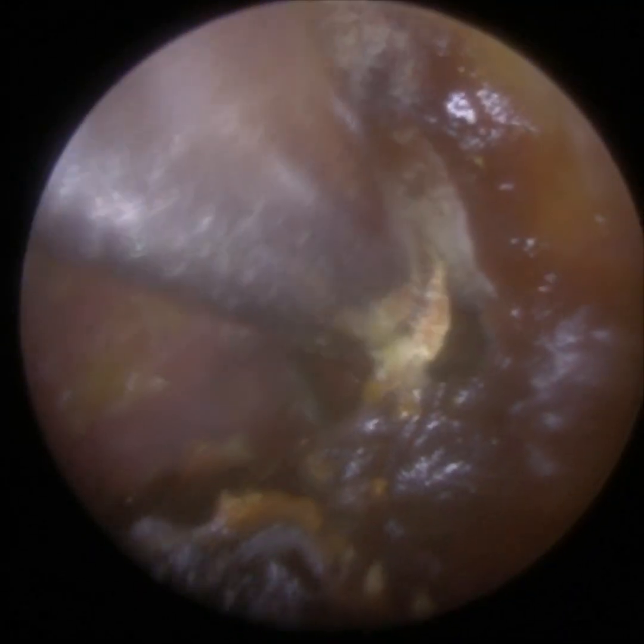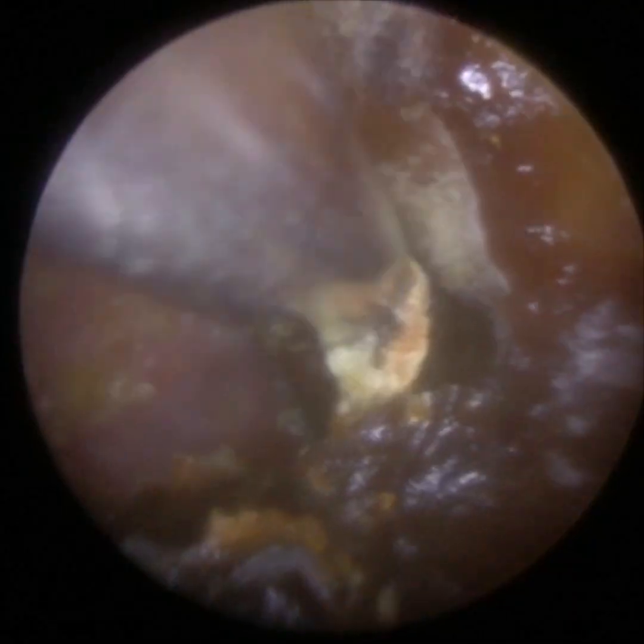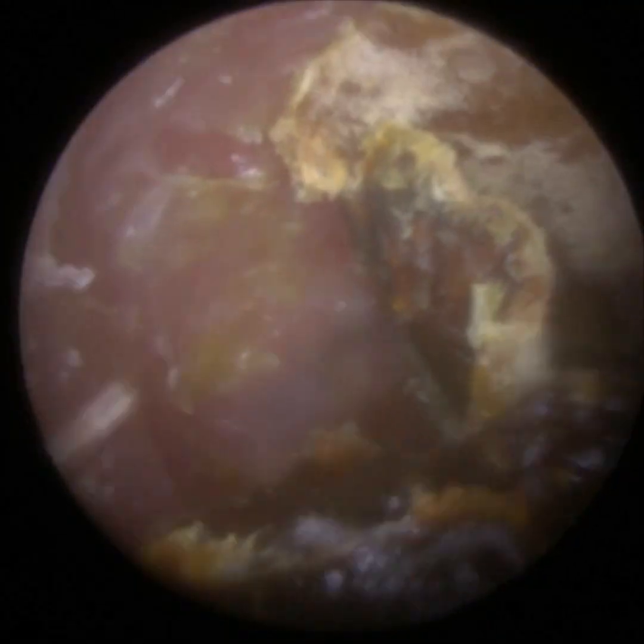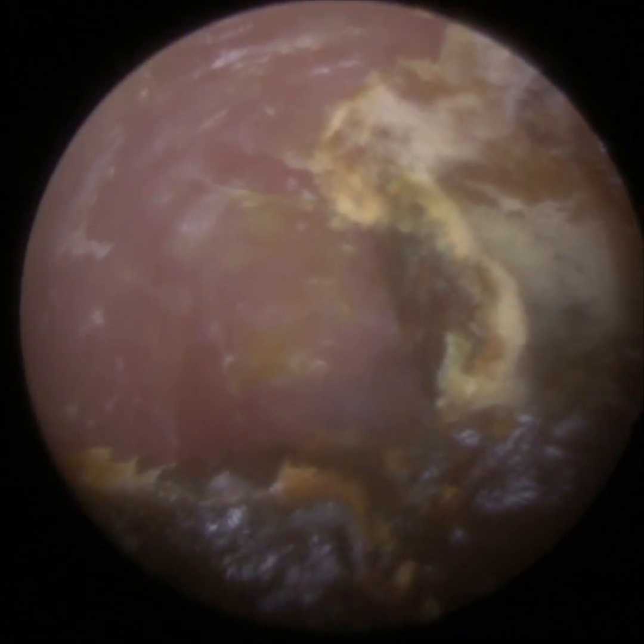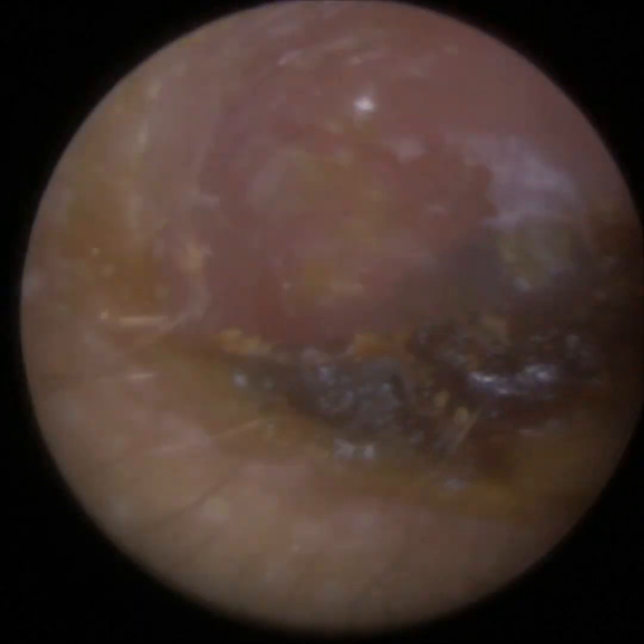And you can see quite often when you're performing clinical ear care, you have a cacophony of instruments, a wide range of instrumentation we can use. And you use them in combination. You use them to support each other sometimes. So there we've used the suction probe just to move the skin a bit lower down, away from the canal wall, so I don't make contact with it with the forceps. I then enter with the forceps and I'm bringing it forward. You can see there's a large piece of crusted dead skin there.